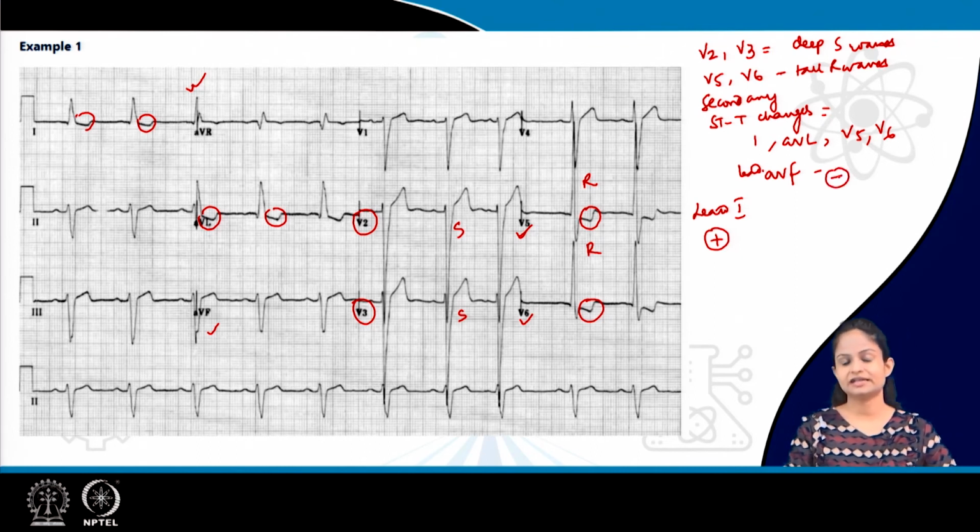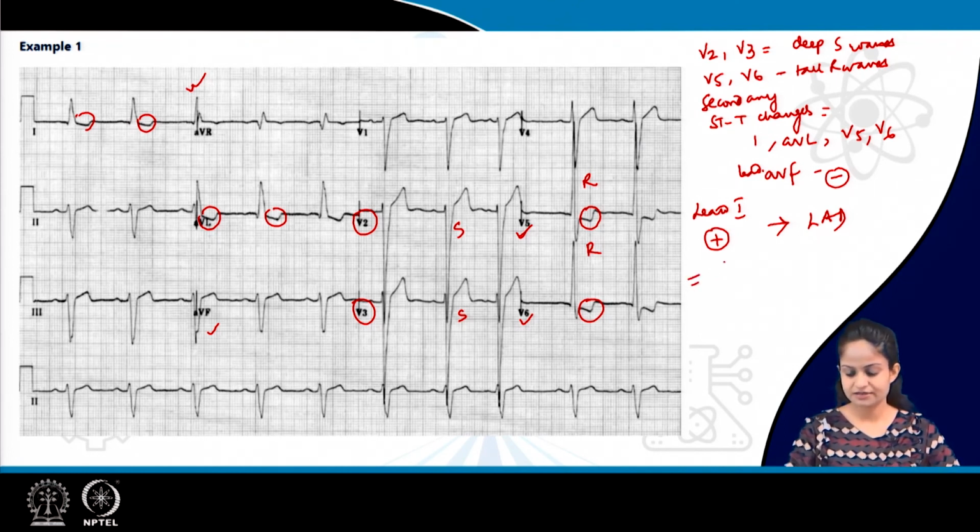If you remember the quadrant approach we have discussed, it is nothing but left axis deviation.